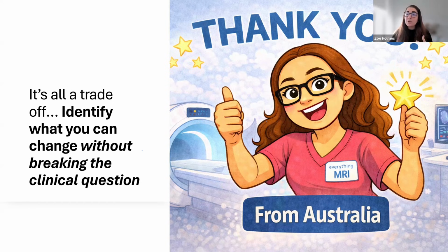So just remember, the best protocol is the one that answers the clinical question for the patient you have on that table at that time. It's not the one that looks the prettiest or a perfect phantom. It's, is my imaging going to answer my clinical question? It should always be at the forefront of your mind as an MRI radiographer.